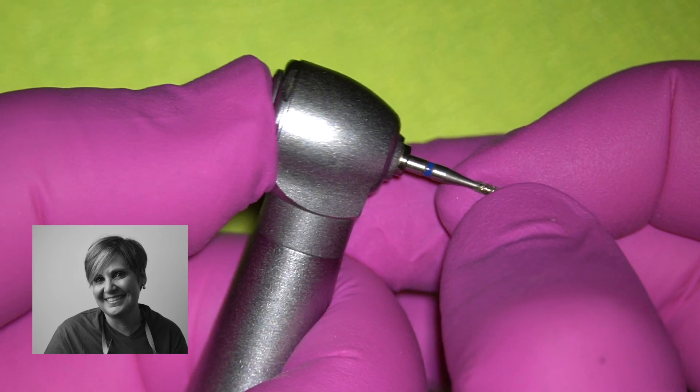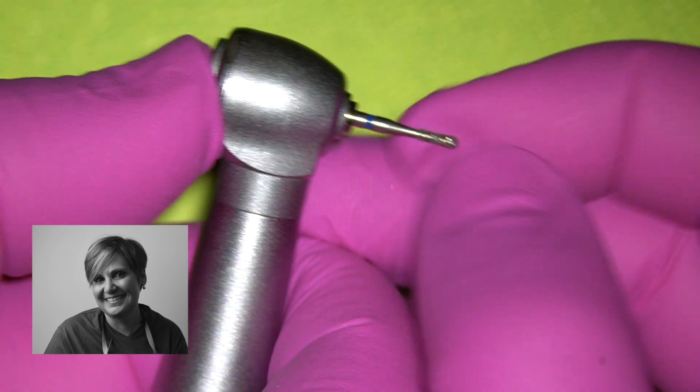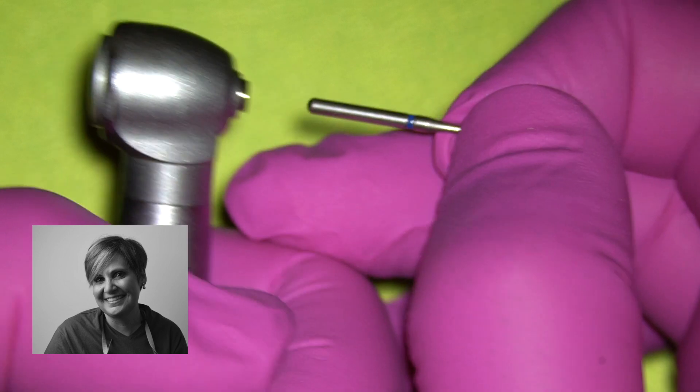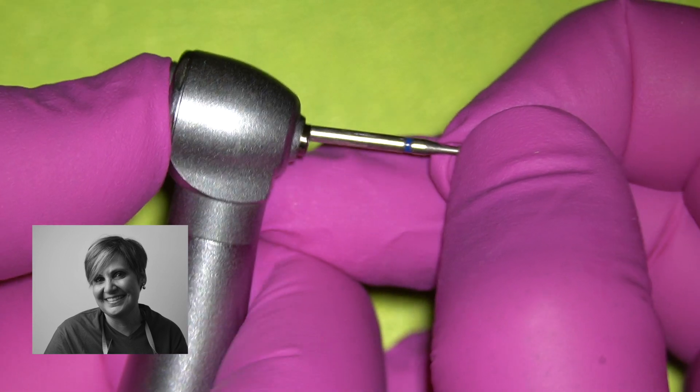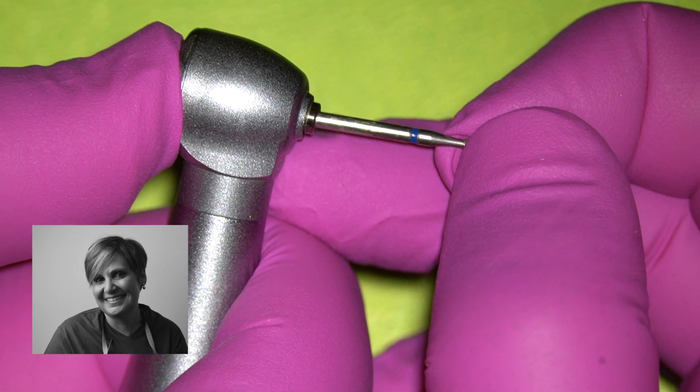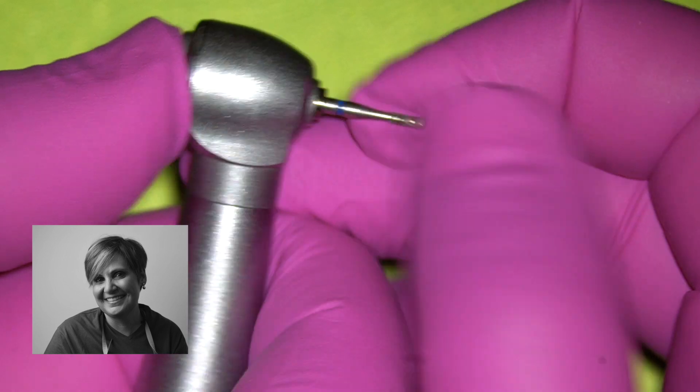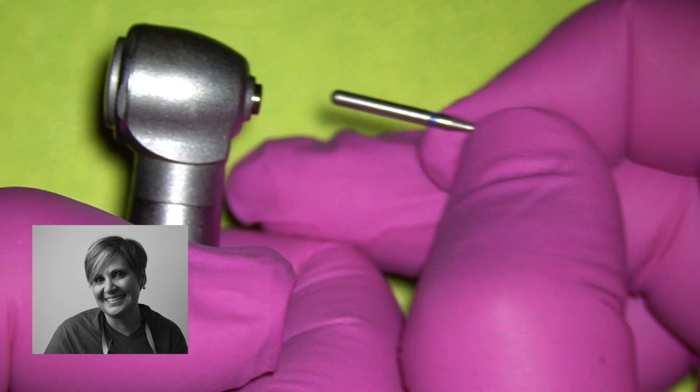The first problem is that the shank of a cheap bur doesn't fit exactly in the handpiece. As you can see here, I insert a no-name bur and I detach it very easily.